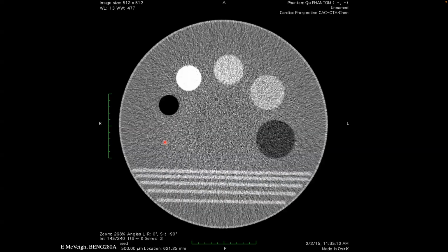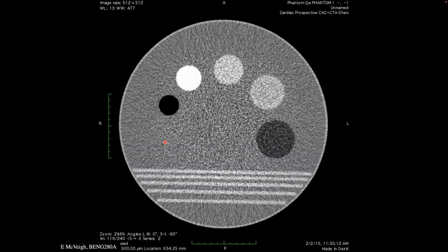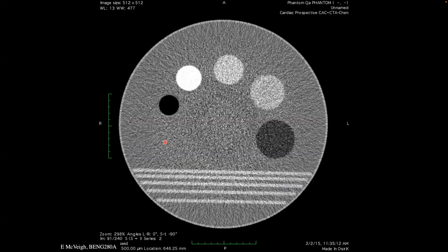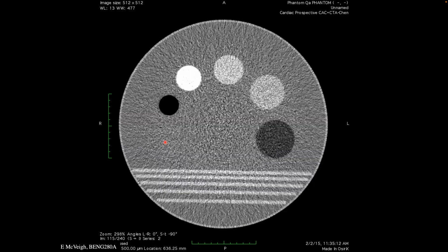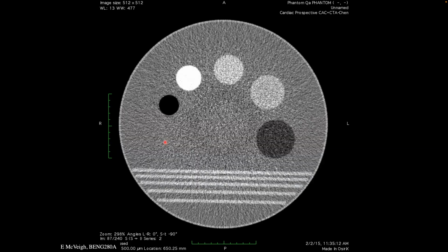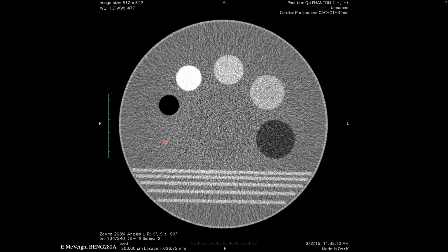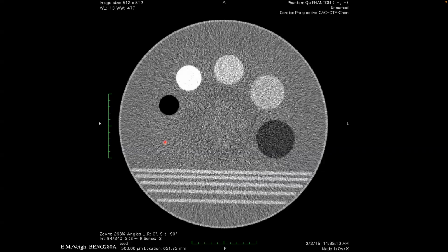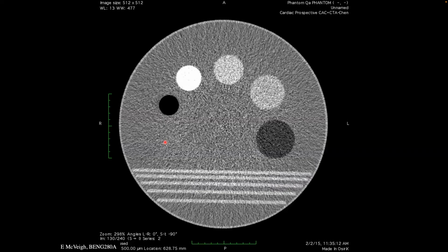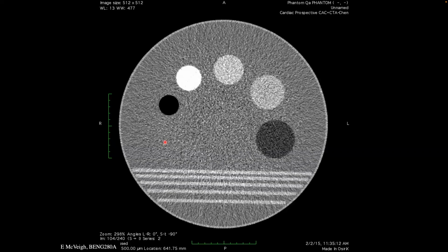This is a bit of a cheat, because to do this absolutely correctly, I would have sat at the scanner and scanned like 500 images of the same slice and then played the movie of the 500 images. The way I cheated here is I took a phantom that doesn't change in Z, because these are cylindrical objects, and I'm just paging through those slices.